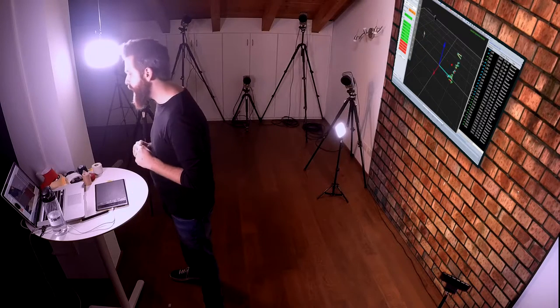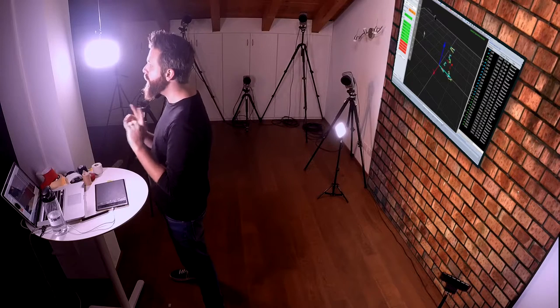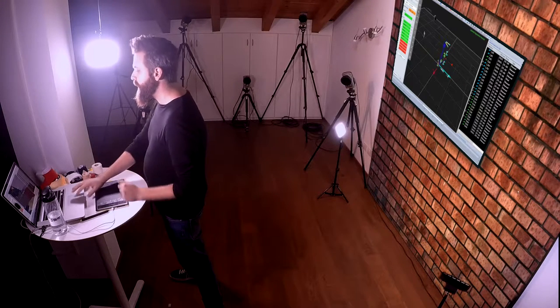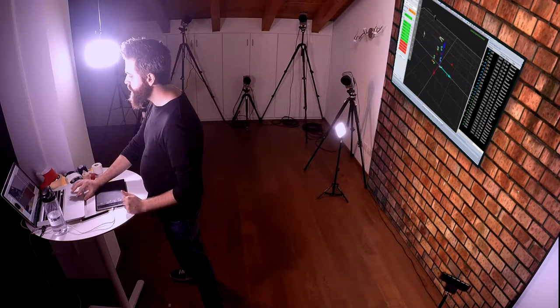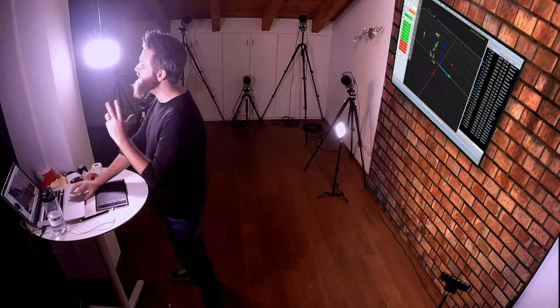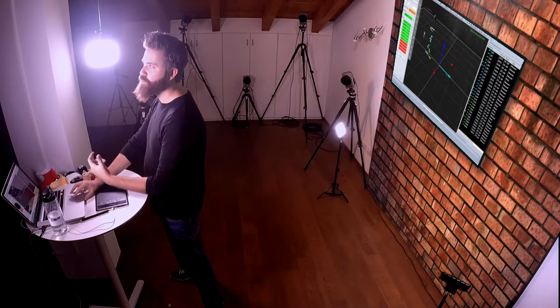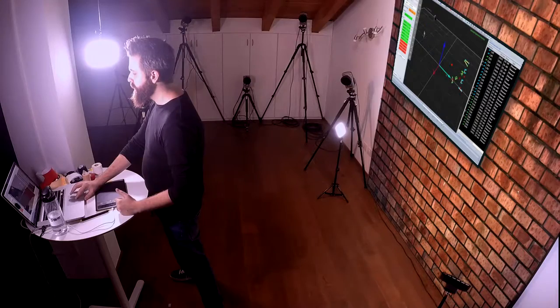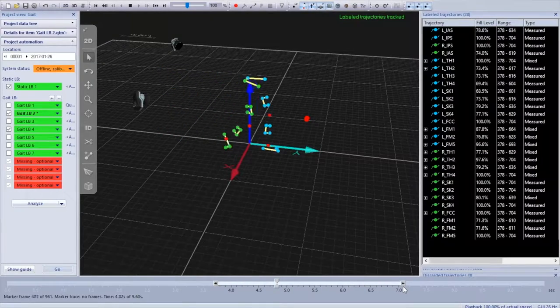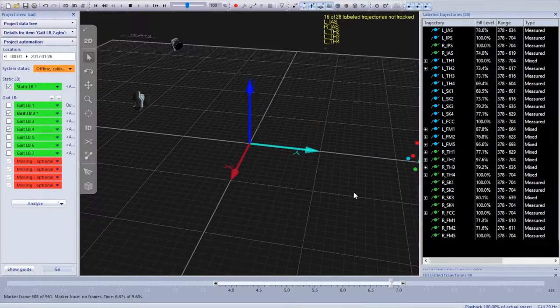I should highlight one other thing. Although not a requirement, I have trimmed this trial to be just the area of interest of the trial that we want to record. See, if I widen this you see our subject here walks out of that area of interest.